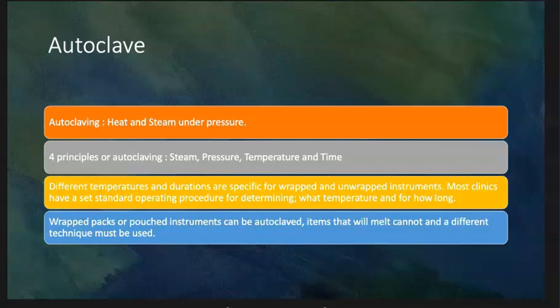There are recommended storage times for sterilized packs. Double wrap packs have a shelf life of 4 weeks. Double wrapped 2-layer or double thickness, heat sealed in a dust cover after sterilization, has a 6-month shelf life. Double wrapped 2-layer or double thickness, tape sealed in a dust cover is 2 months. Double wrapped non-woven barrier or paper is 6 months.